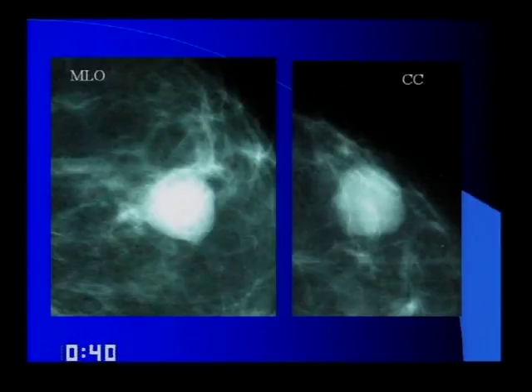And your differential diagnosis before the ultrasound? I see. Well, some history would help. I'd like to know how long this has been around, if she's had any trauma to the breast. No trauma. Okay, so it could be a breast cyst, an area of fat necrosis. Well, again, you said there's no trauma, and so I exclude fat necrosis or hematoma. I'd like to know if it's cystic or solid, so I'd do an ultrasound.